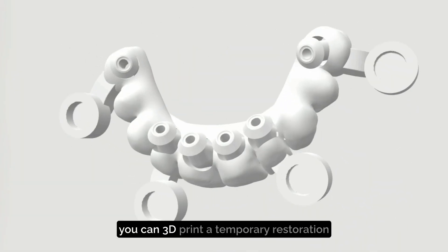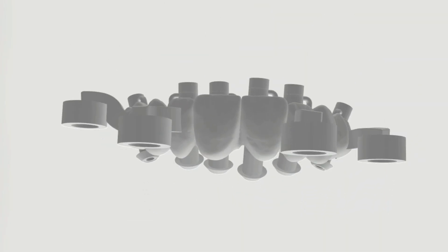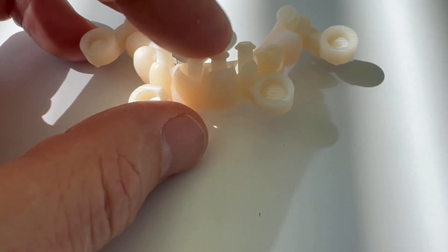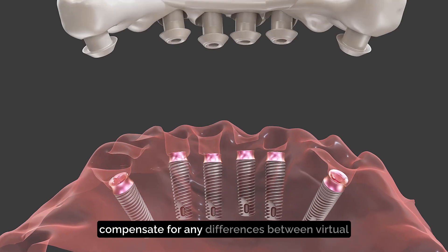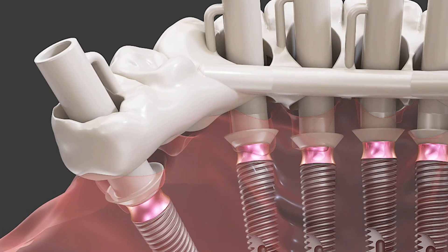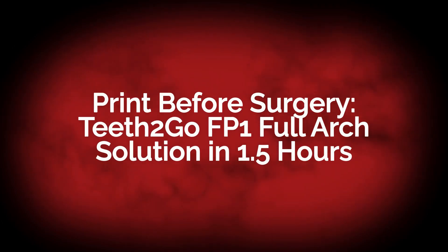With Teeth to Go, you can 3D print a temporary restoration before the guided implants are even placed. This is made possible by the patented FlexFit technology, which provides the flexibility to compensate for any differences between virtual planning and actual implant positioning. Now let's take a closer look at a real case and see it in action.